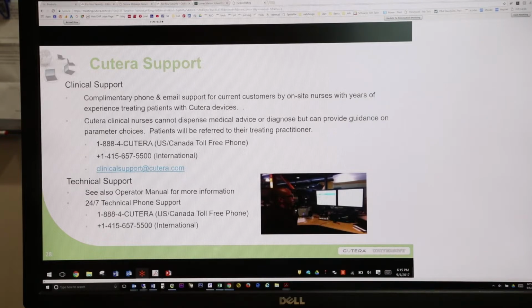So it's going to give you a nice glow from the treatment, because what picogenesis does is cause injury to the skin, forcing the skin to remodel itself and come back even more buoyant, even brighter than normal. Now you will see people with mottled faces, mottled appearances to their face.